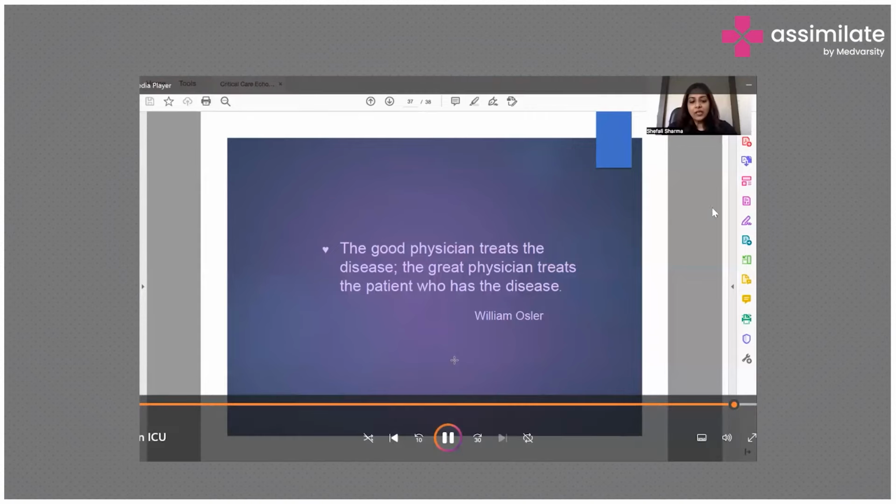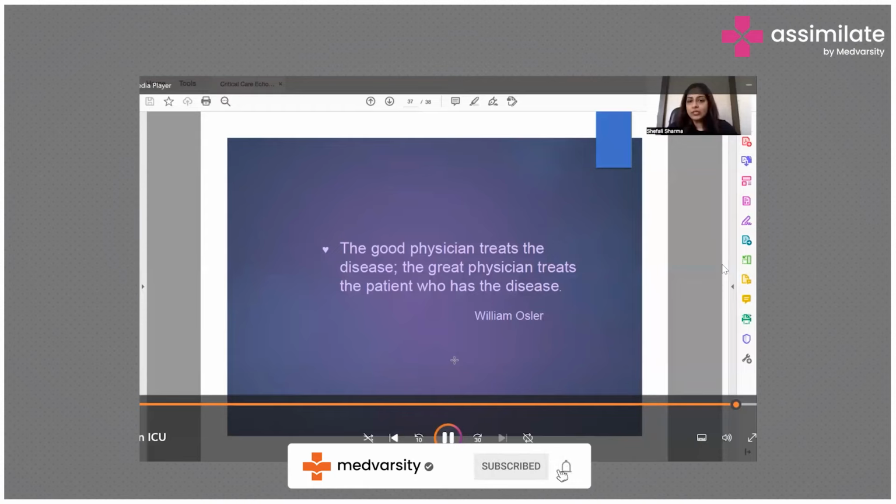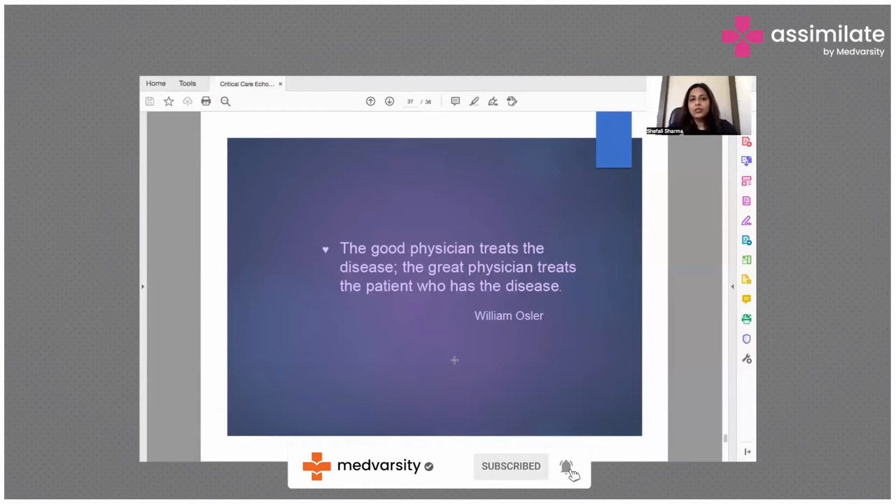You need to have the echo established in your diagnostic and treatment protocol, because when you do bedside echo, you can definitely look at the heart and the probable things happening to it. You have to see the fluid assessment. You have to look at the inferior vena cava for distensibility and other factors.